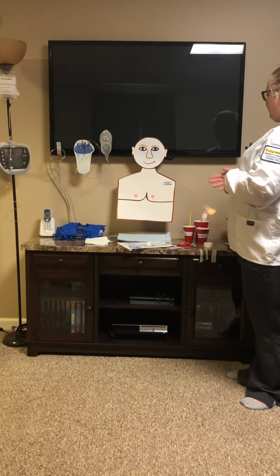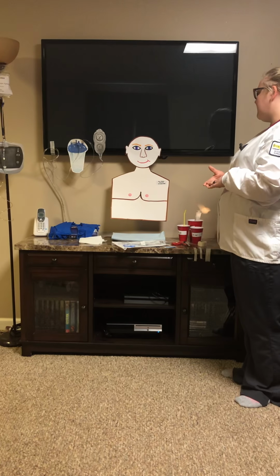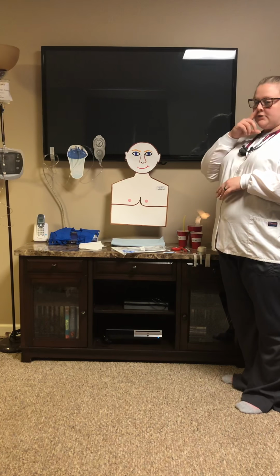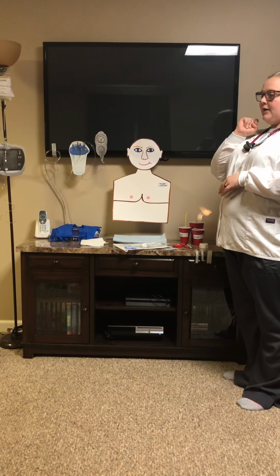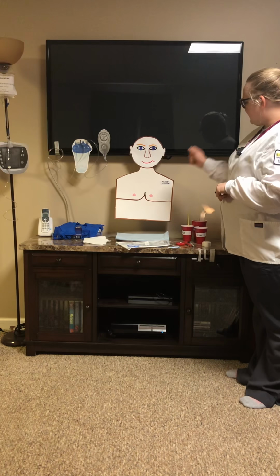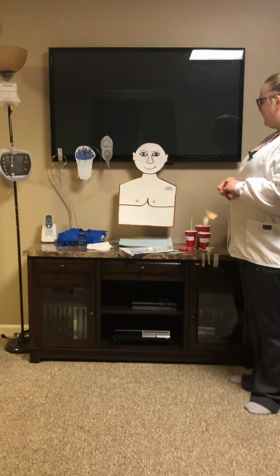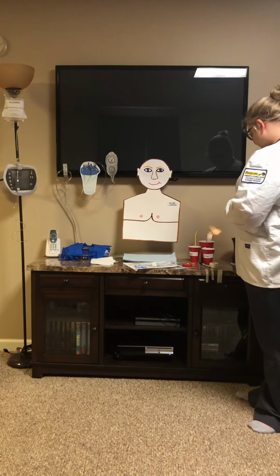Mr. Doe, do you have a history of broken nose, deviated septum, or recent oral or dental surgeries? I would assess the patency of his nares. I would have him plug one nostril and breathe, and do the same with the other nostril and breathe. I would assess his nose with my pen light for patency, skin breakdown, and lesions. I would also try to choose the larger nostril for placement.